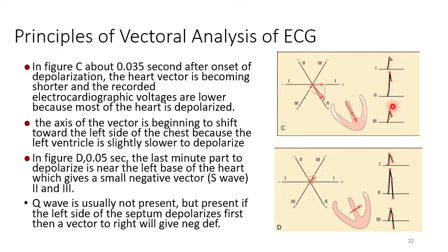That's why the ECG line moves downward, and the drawing is proportional to the length of the projected vector. So in 1 we have a line, in 2 a larger line, and in 3 a line that is shorter than in 2.